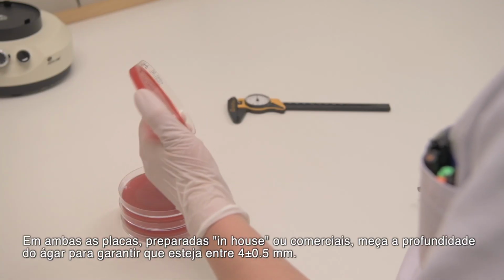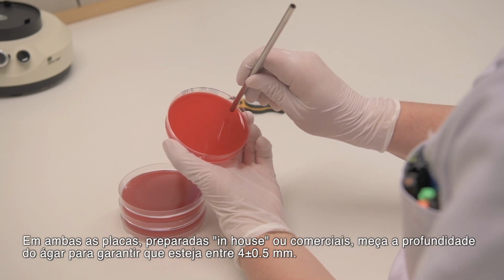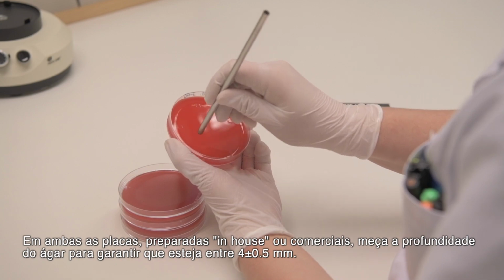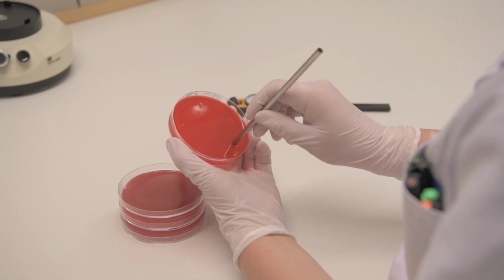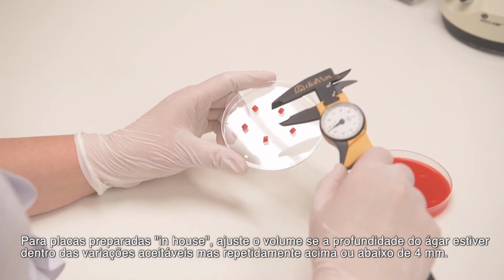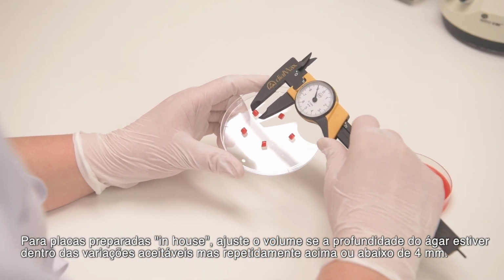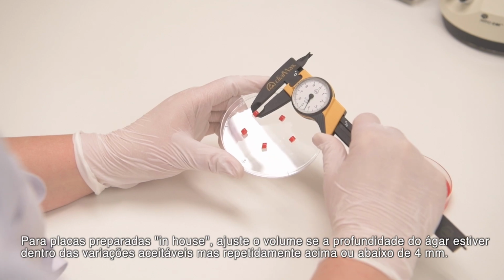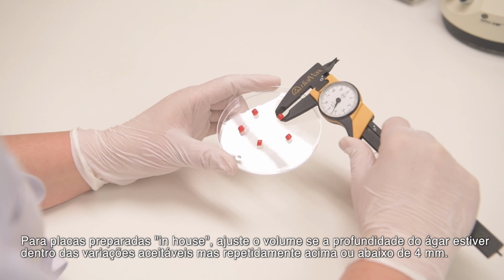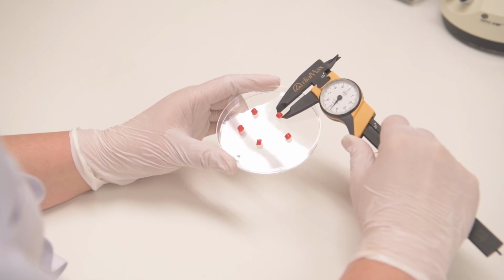Both for in-house prepared and commercial plates, measure the agar depth to make sure that it is 4 ± 0.5 millimeters. For in-house prepared plates, adjust the volume if the agar depth is within the acceptable range but repeatedly above or below 4 millimeters.